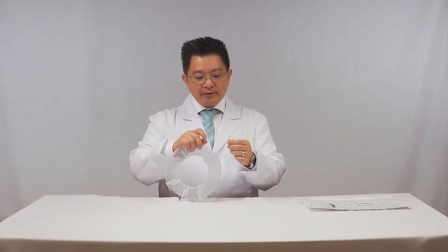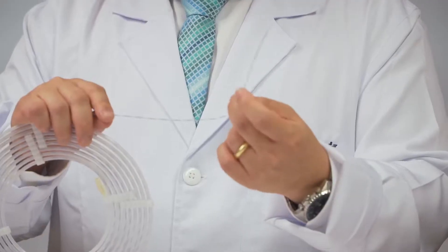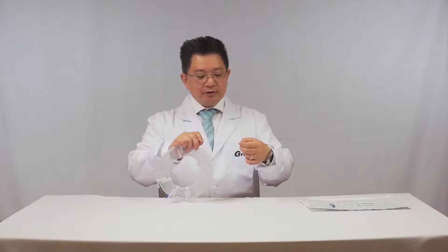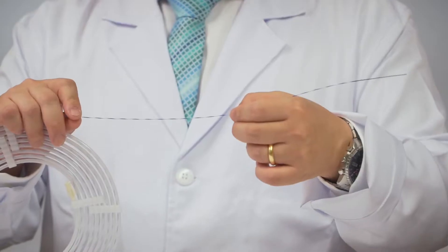One problem of this type of guide wire is the stiffness — it's very flexible. It can pass non-straight lesions, but it's very difficult to pass, for example, self-expandable prostheses and stents.